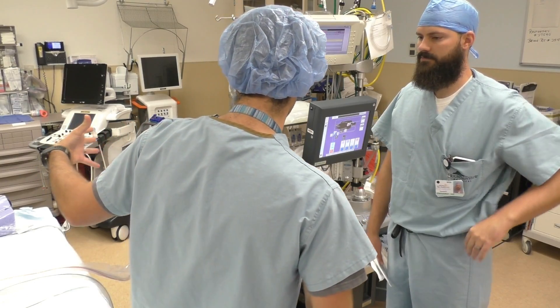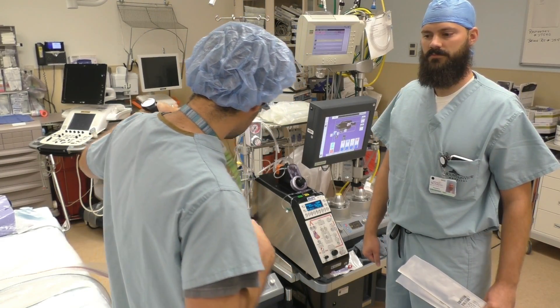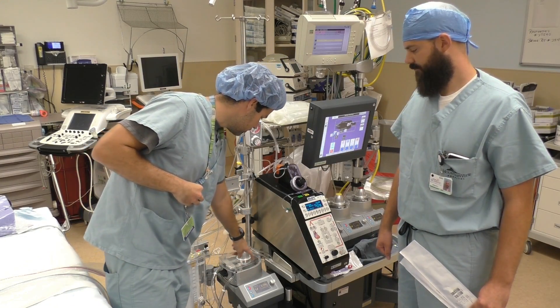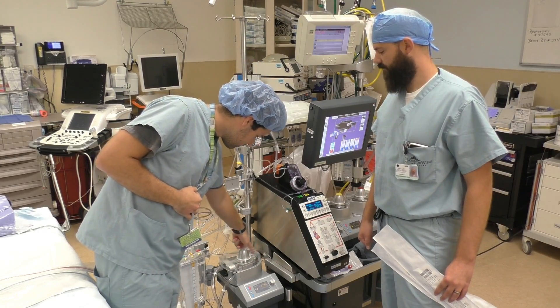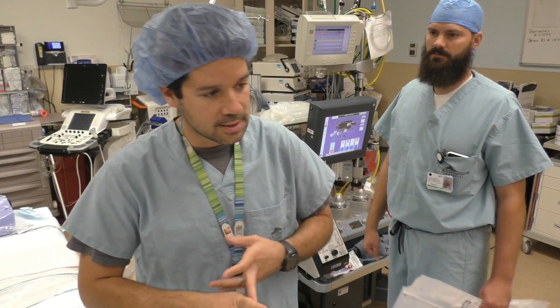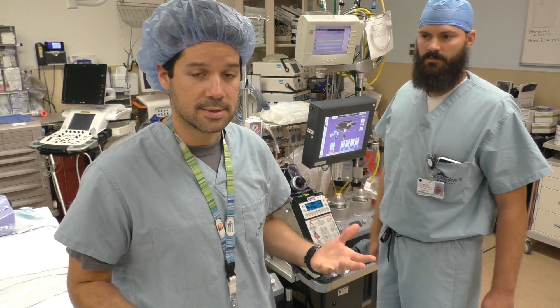The blood that is being taken from the field through the tubing hooked up to the perfusion machine — the venous blood — goes directly into the reservoir on the pump, moving into this component which is basically the heart of the machine, because it's pumping the blood. Through here into the oxygenator, it's oxygenating the blood and then giving that blood right back to the patient. So the organs stay intact, the brain is still perfectly fine and oxygenated. Everything with that patient is perfectly fine as we work on the heart and as that heart is arrested.